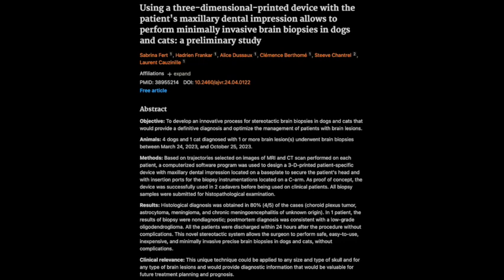So as we wrap up this part of our deep dive, what are some key takeaways? One is the value of minimally invasive techniques. We're continually striving to find ways to diagnose and treat our patients with less pain, less risk, and faster recovery times. And this research is a perfect example. It is, and it highlights the importance of personalization. This 3D printed device demonstrates how we can tailor treatments to the individual needs of our patients. It's about finding the right solution for each specific patient.